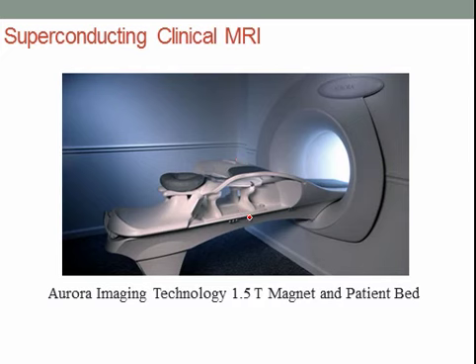And what you see here is this table is not only something that she lies on, but this is also the RF coil. This part of the bed is a transmit RF coil, and the bottom part of the bed is the receive RF coil. Now this whole sled assembly slides into the bore of the magnet, and of course that's when the imaging happens.